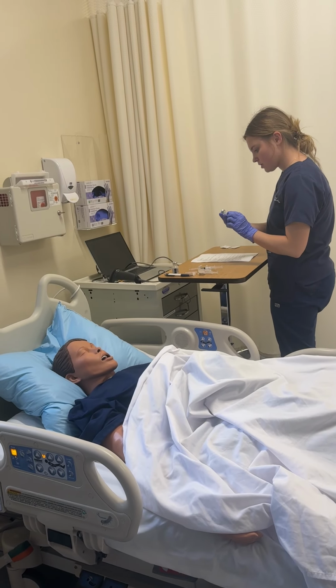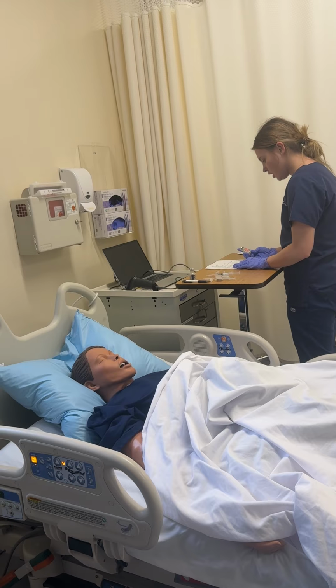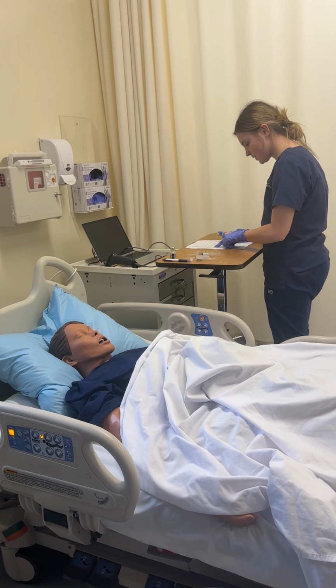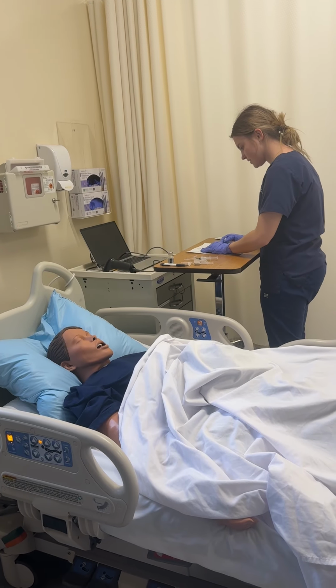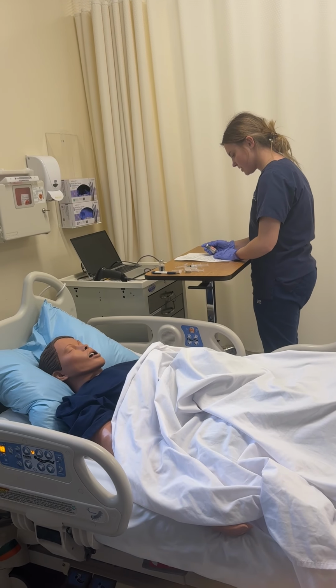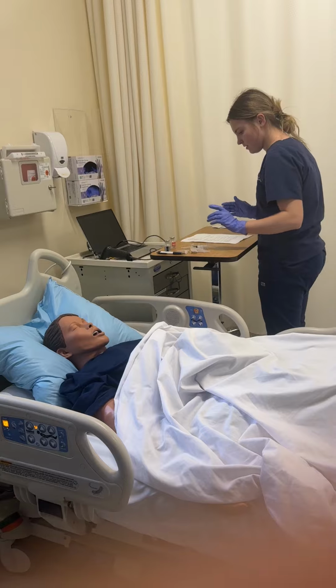We are gonna do our third med check on heparin, which we have heparin. This is to prevent blood clots. 5,000 units per 1 milliliter, which we have 5,000 units per 1 milliliter. We have Sam Johnson. This is going to be subcutaneously, and this is due now since it was last administered yesterday. Okay.